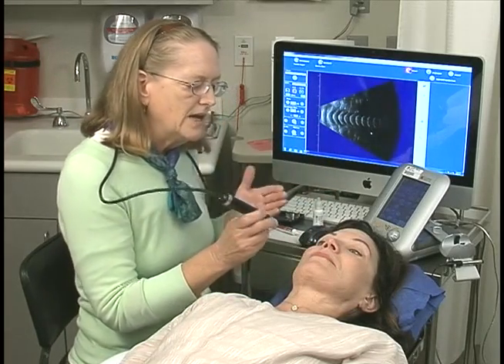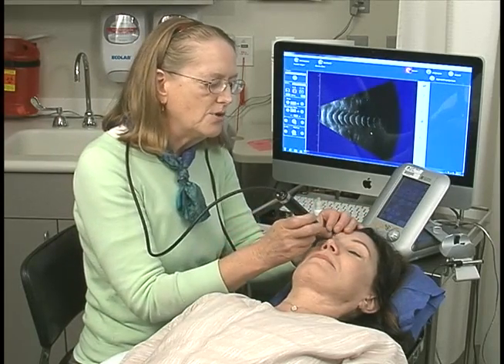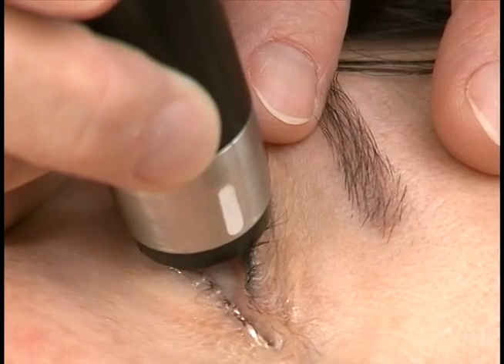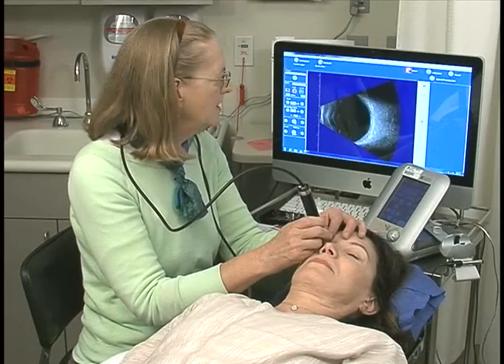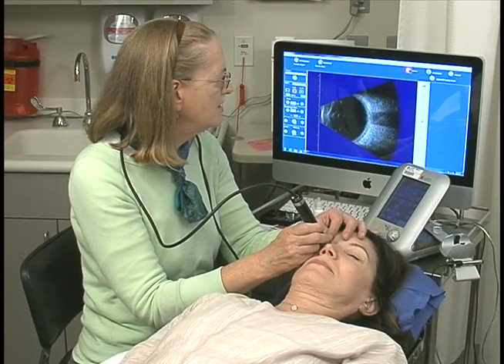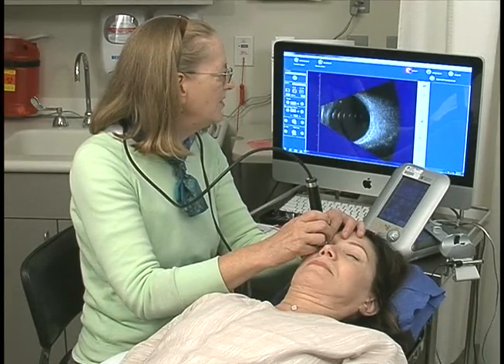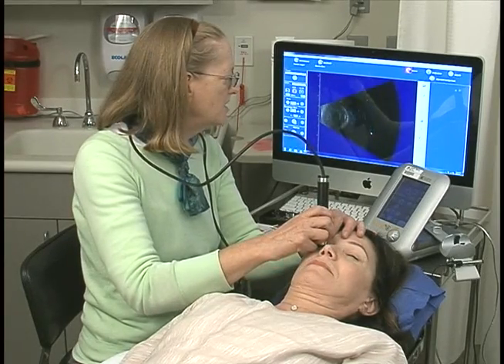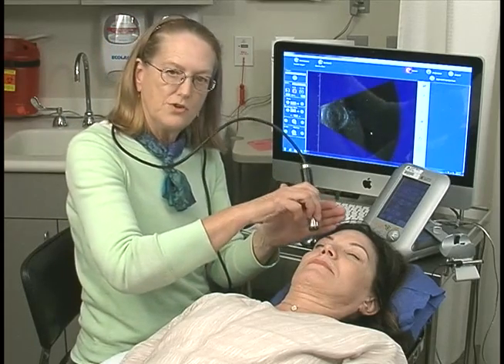Look down to your toes. Now the second exam for horizontal is of the inferior aspect. Marker again to the nose, patient looking down to their toes. Place the probe on the superior limbus and localize the optic nerve — do you see the optic nerve shadow? Occasionally you might need a little lower gain just to see that probe shadow more clearly. There's the optic nerve, so I know I'm always starting at the posterior. Then I sweep the probe up but the sound is going down, now at the inferior equator, and as I go farther out I start to lose contact with the globe. That completes the horizontal transverse of superior and the horizontal transverse of inferior.